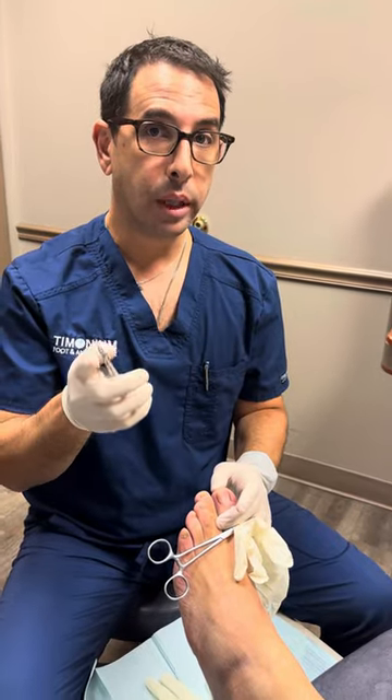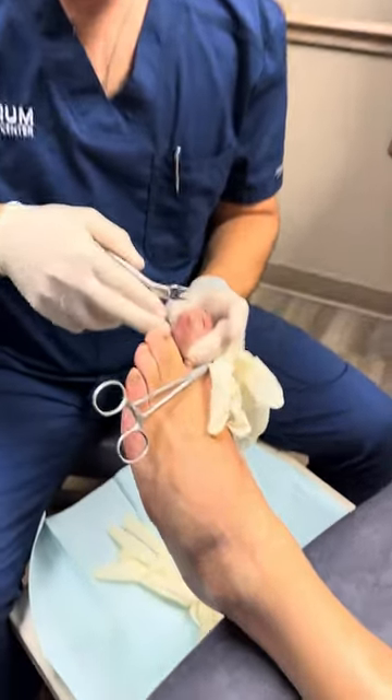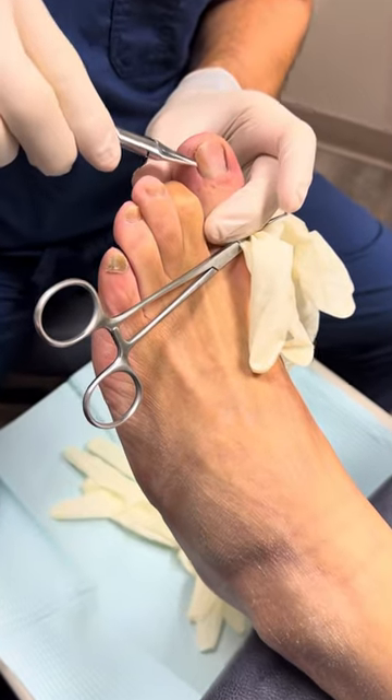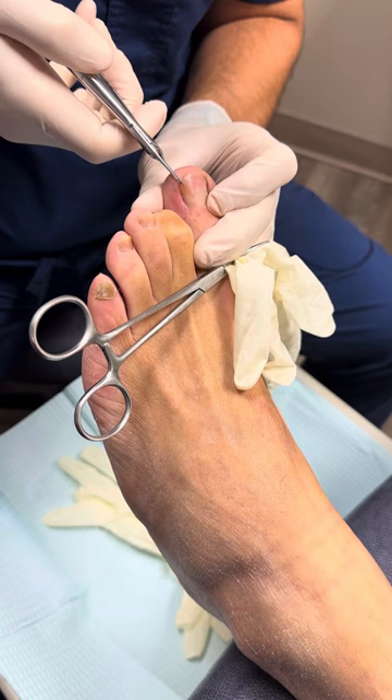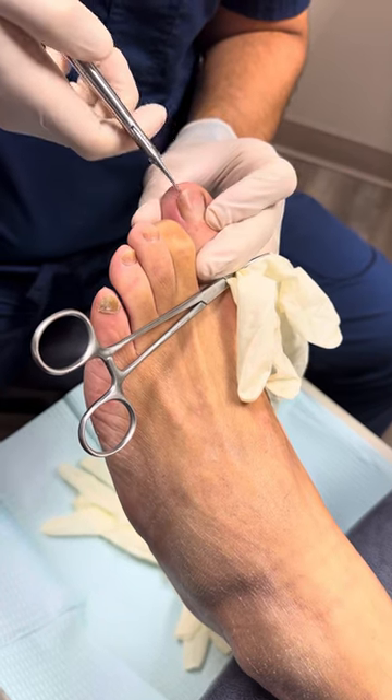We're going to do an ingrown toenail procedure. We have this ingrown nail — we've already numbed him up, which we've shown in a prior video. We've already confirmed with him that it's this side, and we're going to snip the nail.